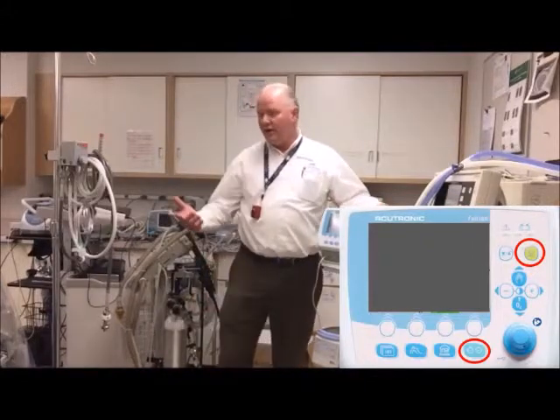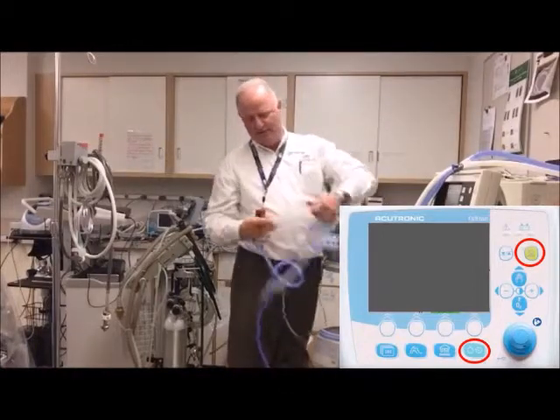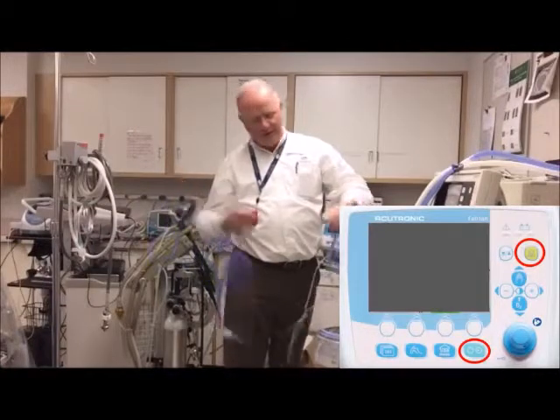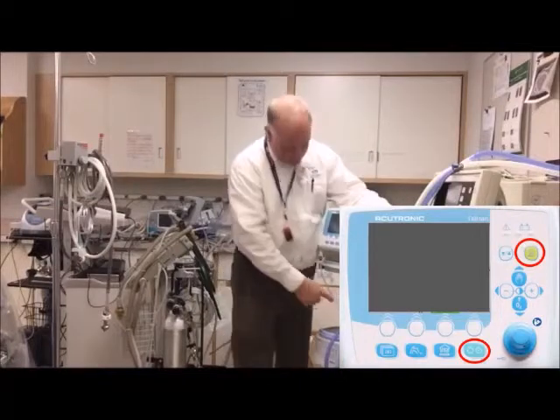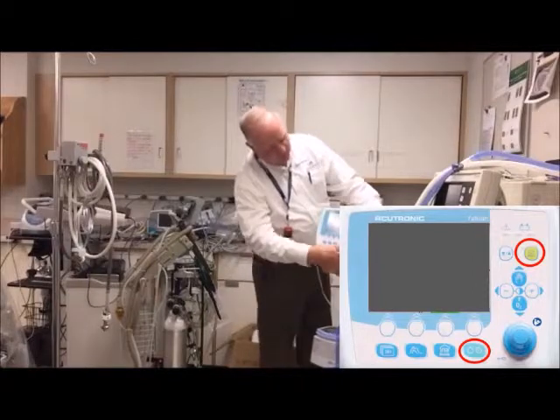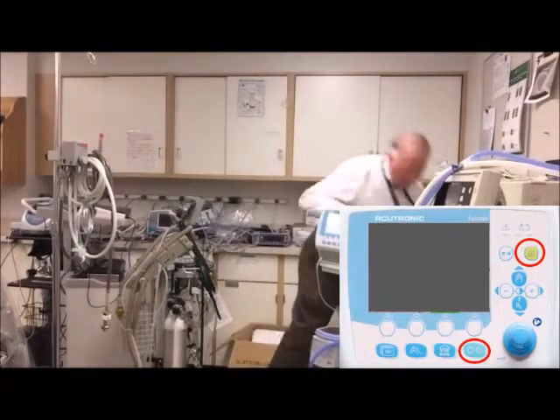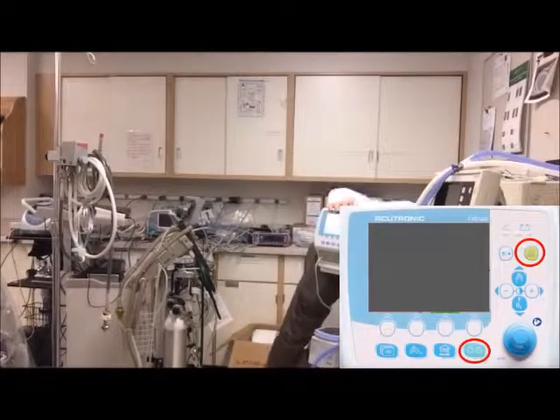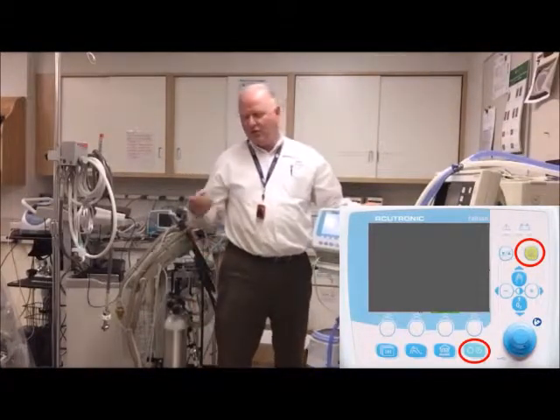If you're doing high-flow oxygen, you can just disconnect here and put a little adapter on for your cannula. You can also put an oxygen filter or air down there. Let me show you the battery indicator: if I unplug it, it changes to yellow. When I plug it back in, it's green. Solid green means it's fully charged or close to it; flashing green means it's charging.